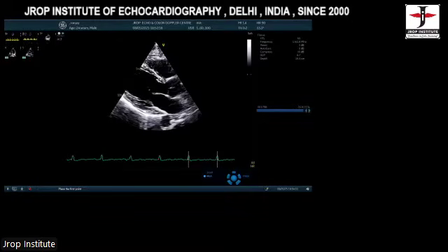Okay. Is it just in the same plane where the mitral valve completely opens? So it has to be just in the same plane, right? Almost, yes. Mitral valve opening happens in almost the mid segment. Look, mitral valve opening is happening in the mid segment, but we are looking at the basal segments. Okay.